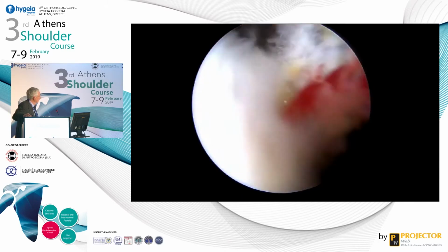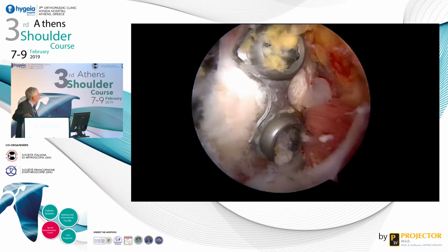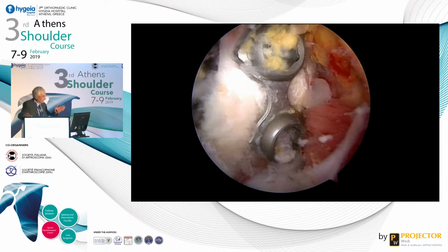You see it's perfectly flush, and you have two screws with the plate, and the direction of the screw is good, and you have no contact with the humeral head with the screw head. You see the screw is in the middle of the coracoid process. It's not too lateral. And I agree with Tom, it's a very tricky step to prepare the coracoid and to put the hole of the coracoid in the right position to have as few problems as possible.